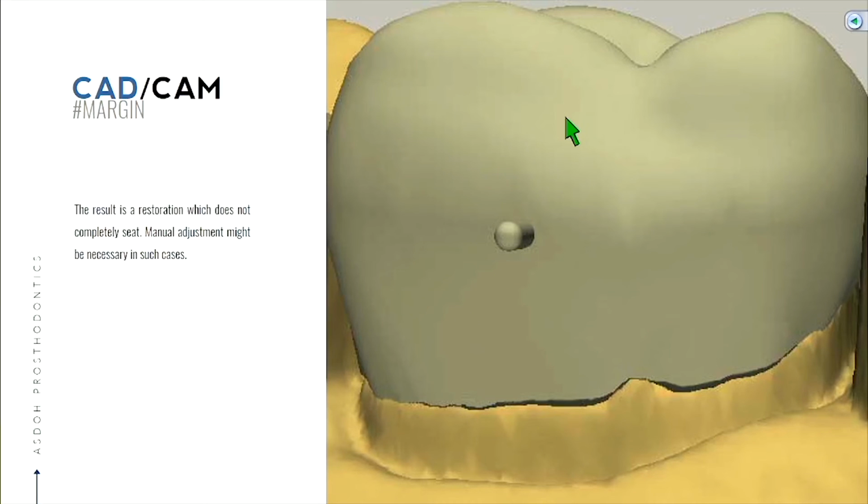Somebody had said earlier, oh, what's a disadvantage of the CAD-CAM restoration? One is the technique sensitivity. You're not able to get away with as much in this CAD-CAM crown in terms of marginal smoothness, right? Even a little discrepancy like that would throw it off. Whereas if you contrast that with a pressed Emax, right, you're still waxing up to that contour and pressing to it. So a press restoration will be able to fit to that little discrepancy. So anything pressed or casted is going to be much more forgiving in that sense. Right? Does that make sense?